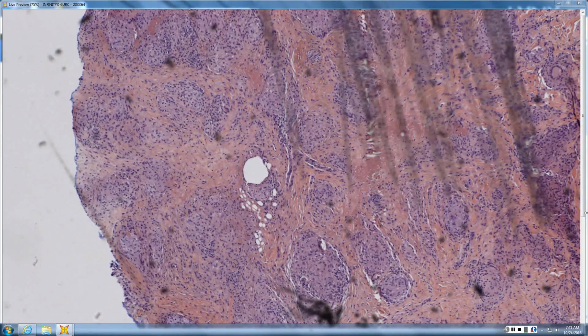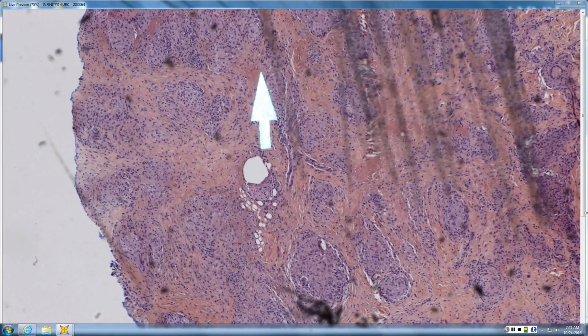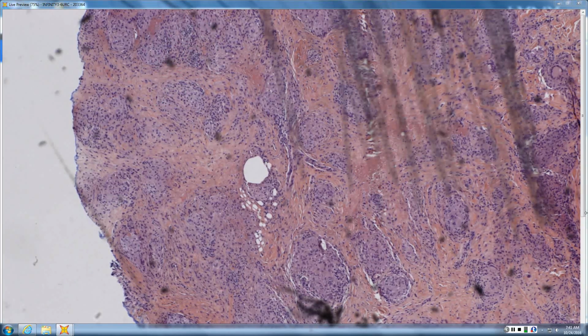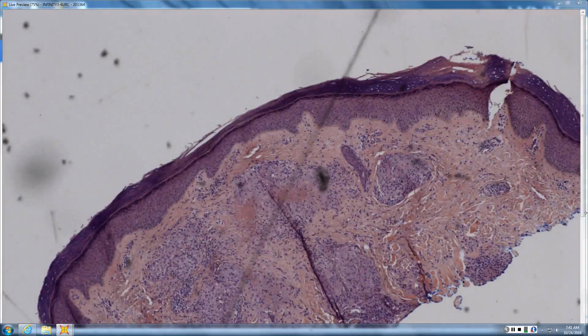So, it used to be that you absolutely had to polarize because it could just be silica. Well, you still polarize and then you see silica, but it still means sarcoid. The brightly staining, really kind of deep staining areas are fibrin. You can get little bits of fibrin in sarcoidal granulomas.